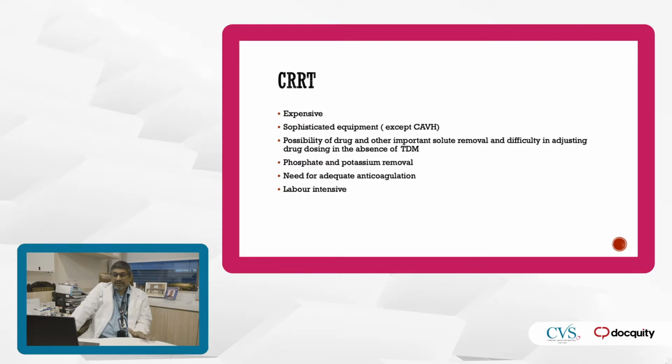Whereas CRRT is more expensive and needs more sophisticated equipment. Because of the continuous nature of the dialysis, important solutes and drugs may be removed. A lot of electrolytes, the good stuff, can also get removed because of the long duration of CVVH.